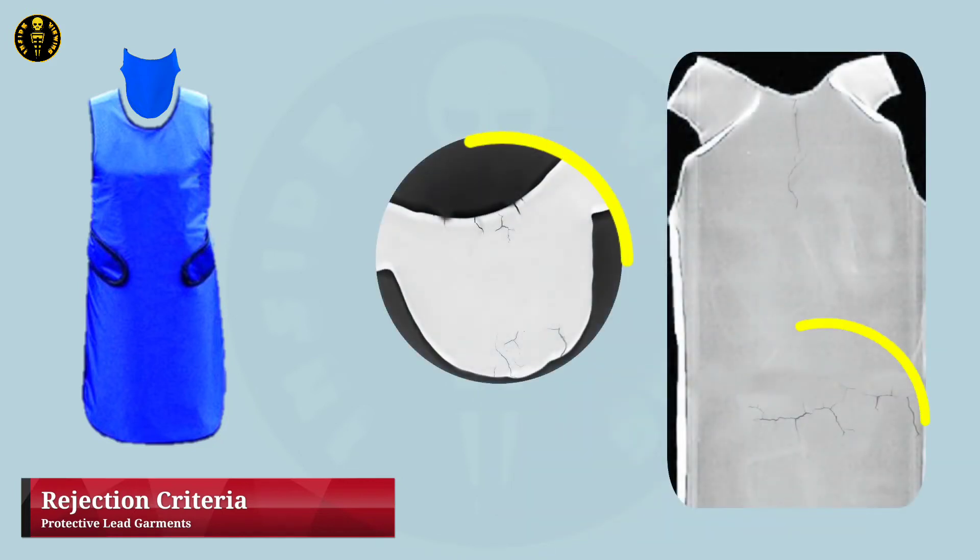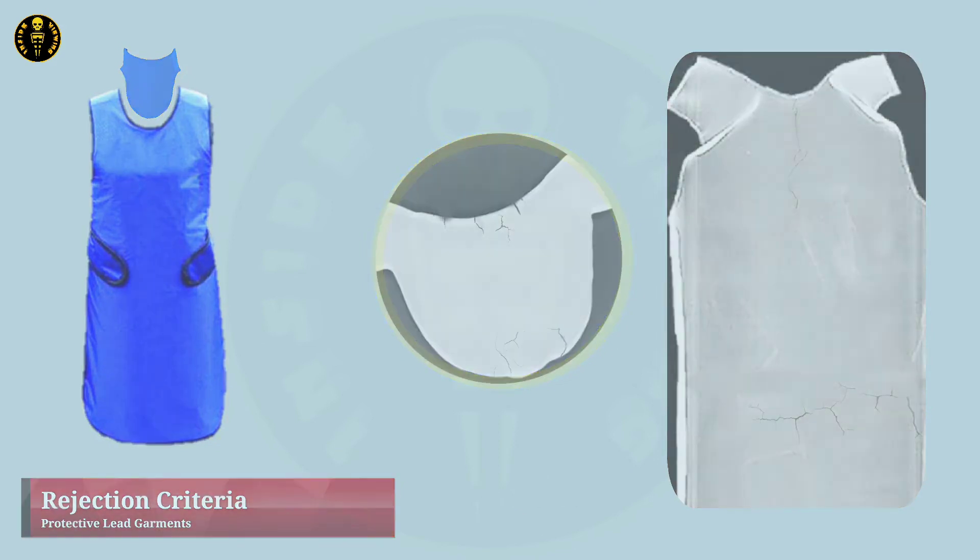If the defects are over critical areas such as the gonads or thyroid, aprons should be replaced if the sum of defects exceeds 11 mm² or a 3.8 mm diameter circular hole. A thyroid shield with greater than 11 mm² defect should be replaced immediately.